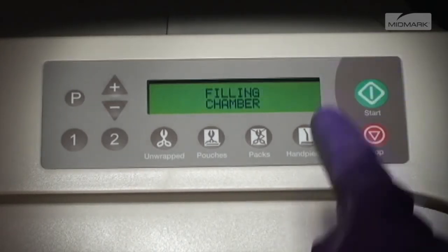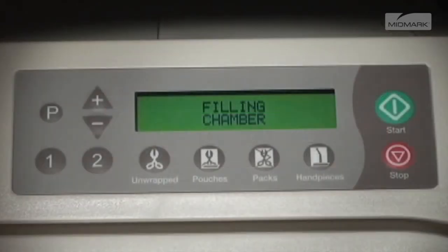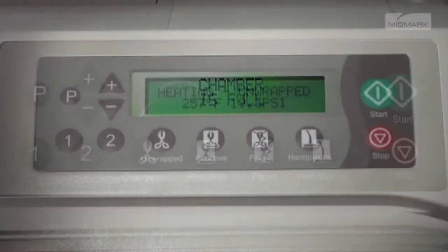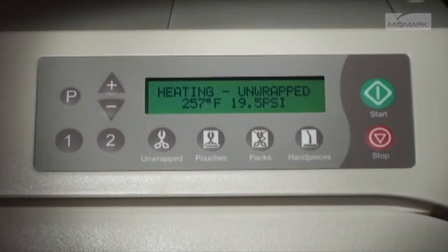Next, you'll push the start button. The display immediately shows the message 'Filling Chamber,' followed by 'Chamber Is Full' when the proper water level is reached. Now the unit will begin to heat to the appropriate temperature for the cycle being used. The display changes as temperature and pressure in the chamber changes.